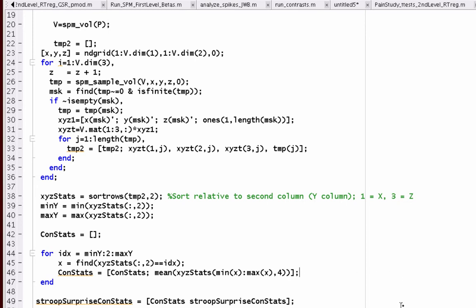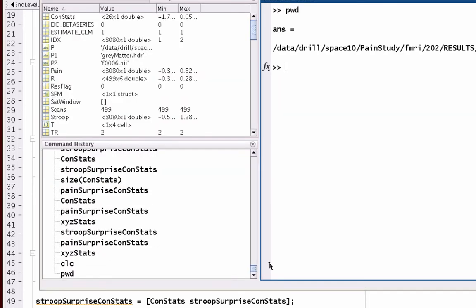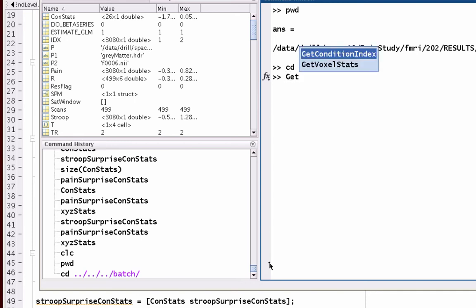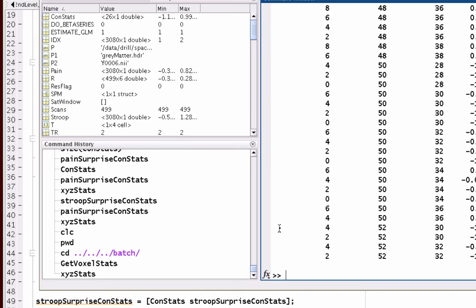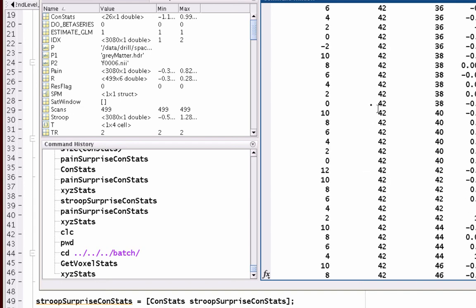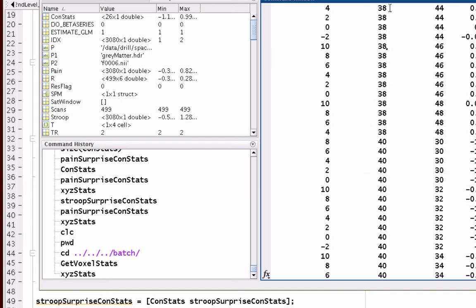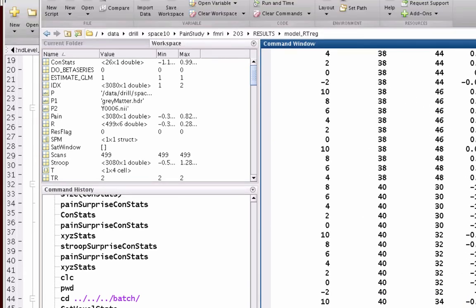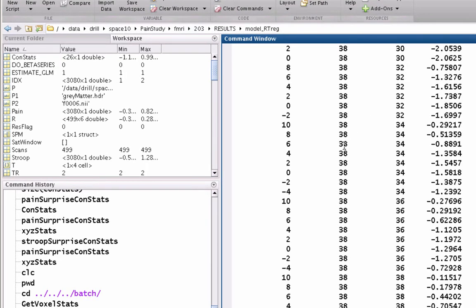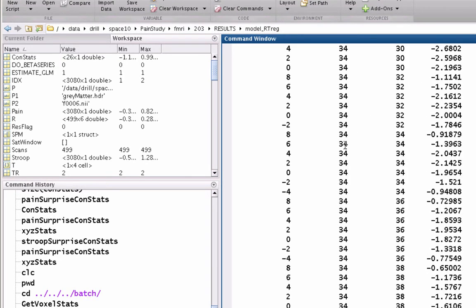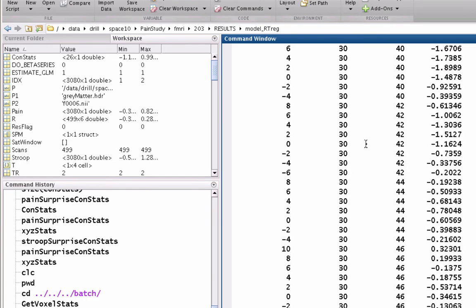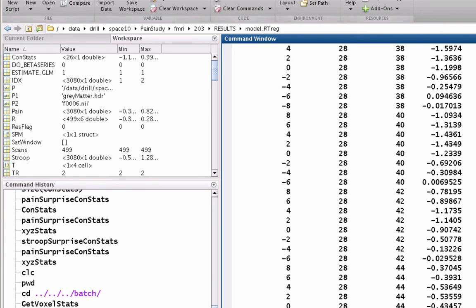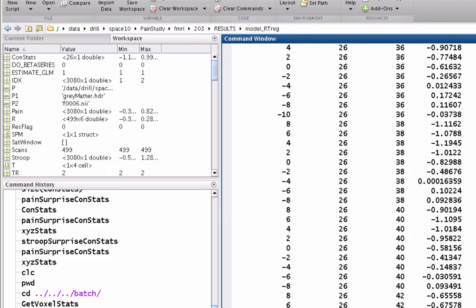If we want to look at some of the guts about how this is happening, if I run this thing. So this is get voxel stats is what I call it. You can copy paste it, just have whatever you want, but so this XYZ stats thing right here. If you look at it, I've sorted it according to row or sorry, column two, which is this guy right here. Yeah. So what you'll notice is that since each slice is two millimeters thick, it's going to be increasing in increments of two. So it's good. Just be aware of how you resample this because I'm assuming everybody resamples to a similar template of two by two by two resolution.